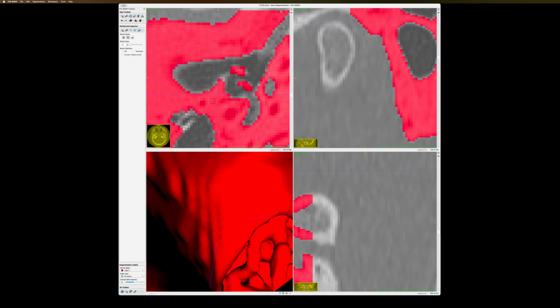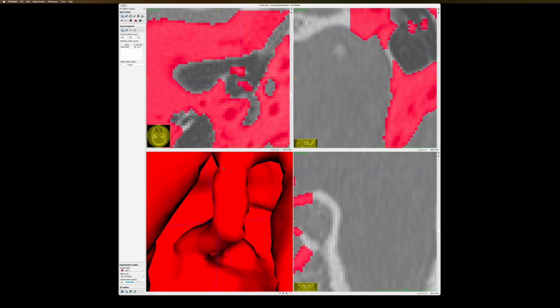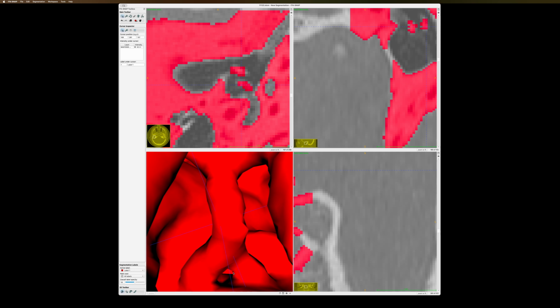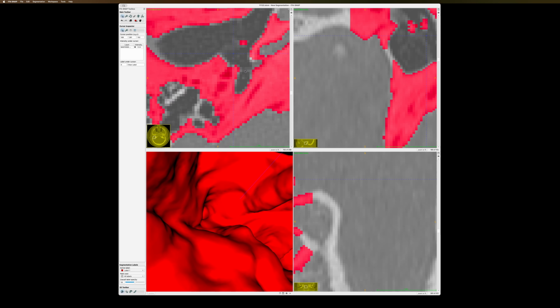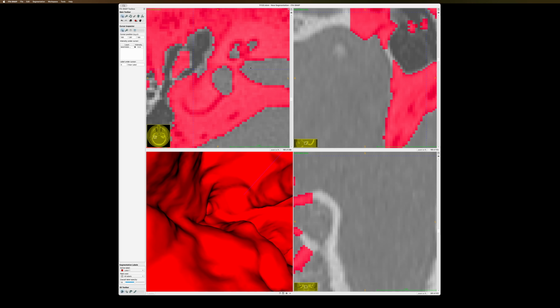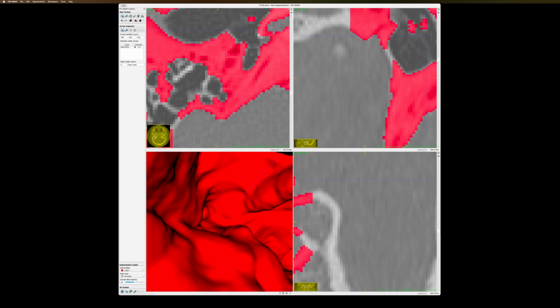So now we look at the updated model. It actually looks reasonable. The stapes is not that fat, but it will do for this. It's important just when drilling the mastoid that you're able to see these landmarks. Since we're not doing any otosclerosis surgery on that resin temporal bone, it won't matter.